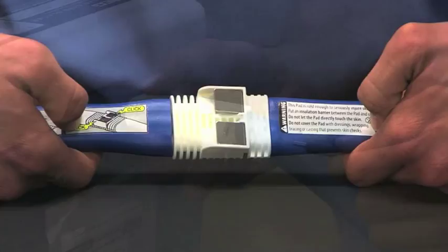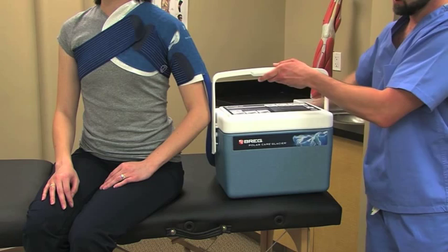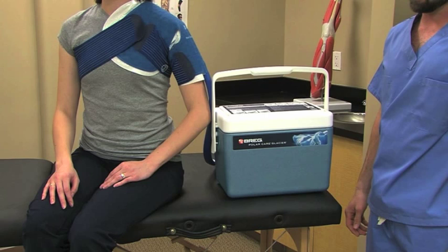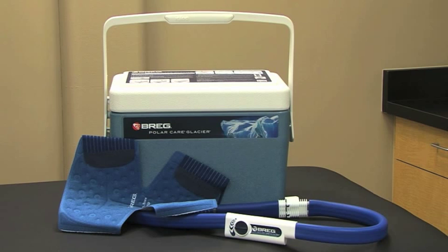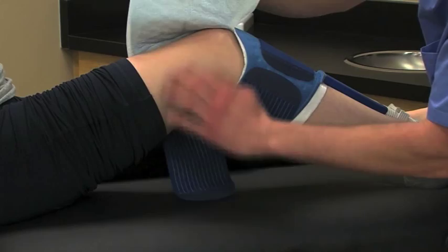Plug the power supply into the DC jack and plug the other end of the cord into a power outlet. Once it has power, the unit will immediately begin circulating water through the pad. The Glacier is extremely quiet, so you may not hear the pump unless you get close. In the unlikely event water leaks from any part of the unit, pad, or connection, stop using the unit and contact your local Breg sales representative or Breg customer care. Be sure to inspect the patient's skin under the pad as prescribed, typically every one to two hours.